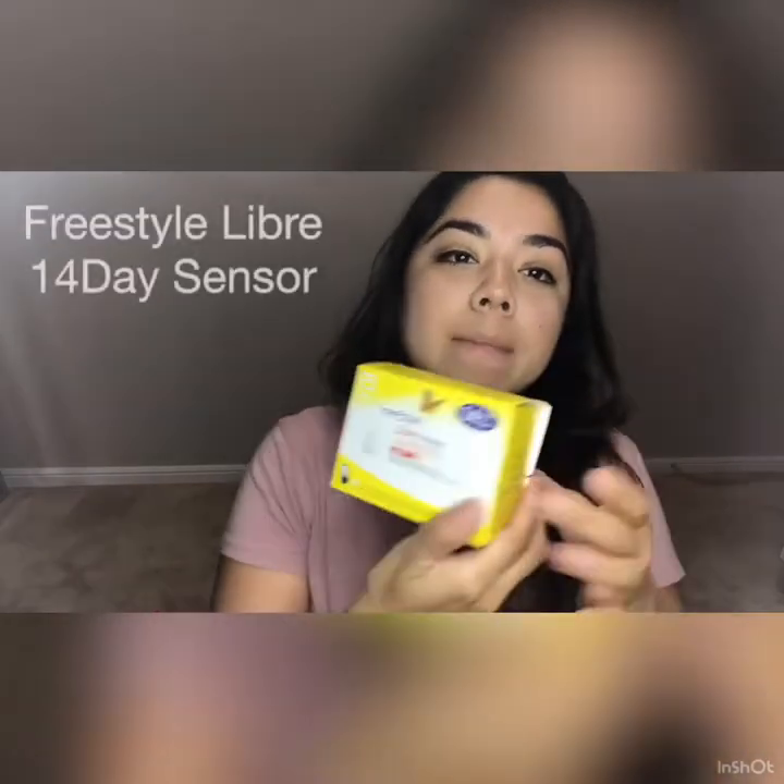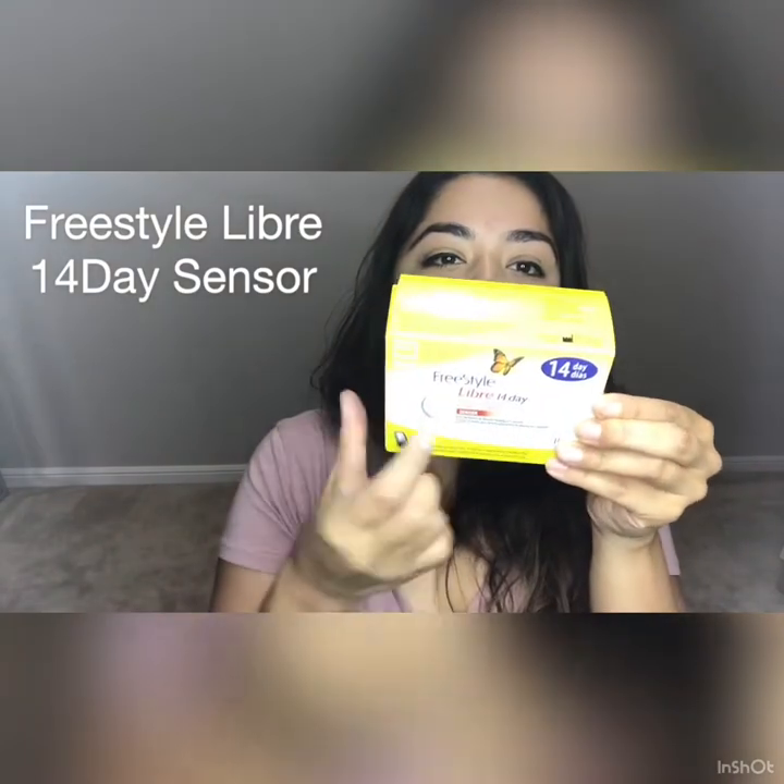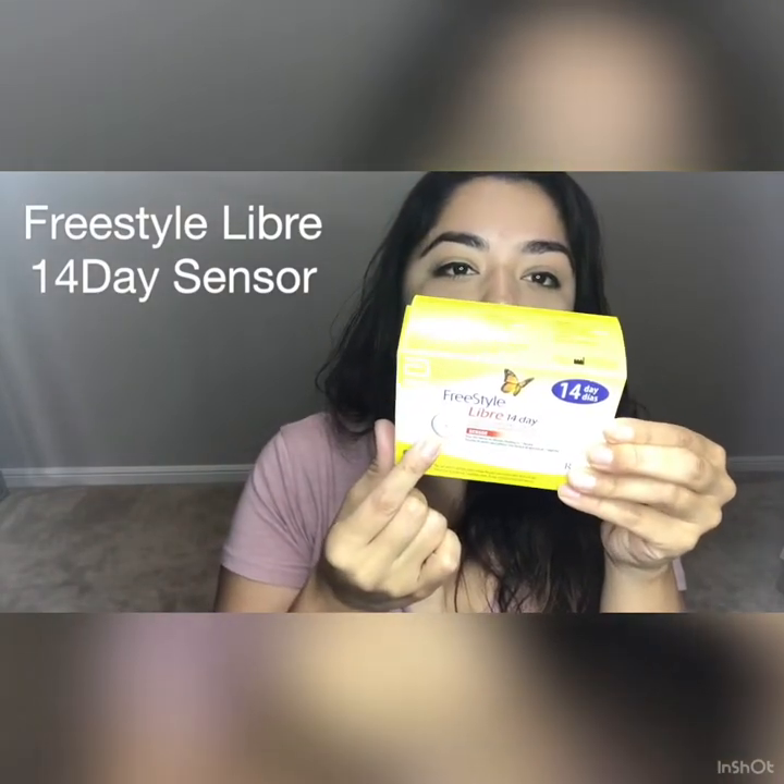Hi guys, today I wanted to show you how I check my glucose reading levels every day. I have this device called the Freestyle Libre — it looks like this little sensor right here.